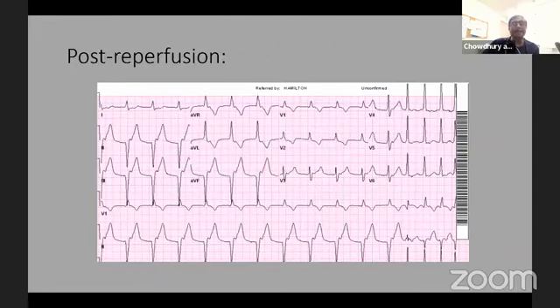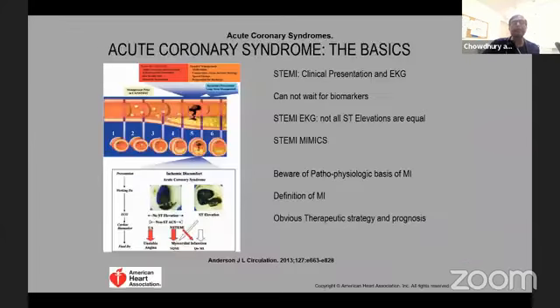And this can happen in the recovery room after reperfusion. This is typical of reperfusion arrhythmia. Just don't do anything. This is not VT, and then the patient is fine. The heart rate is around 90, 100, and then the patient will be okay.